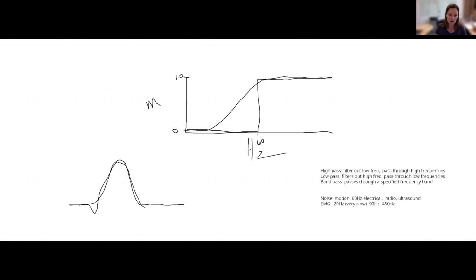And so that's something to look out for. Basically, filters can introduce artifacts into your data, especially if you are using filters that are too constrained in their filter order cutoff frequencies. The reason you might need a sharp filter is that you might have a case where the actual signal is very close in frequency to the noise. But if that's not the case, then it's better to use a lower order filter in general because they end up providing smoother results with fewer artifacts.